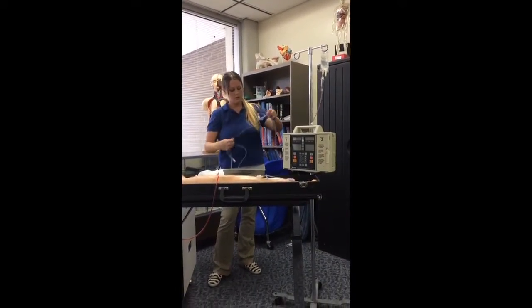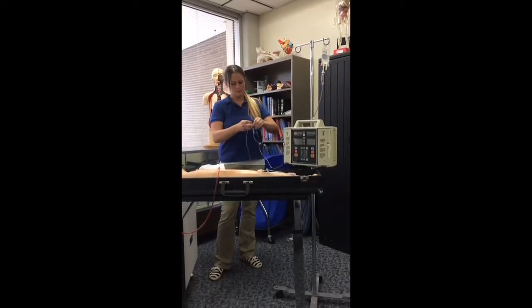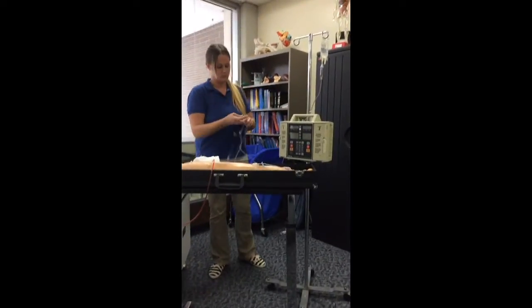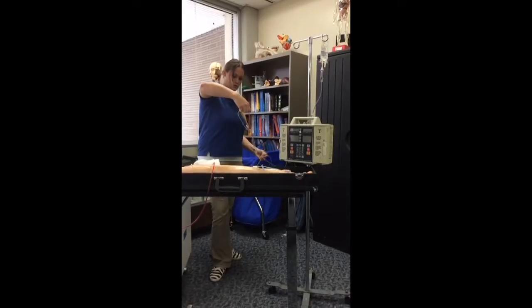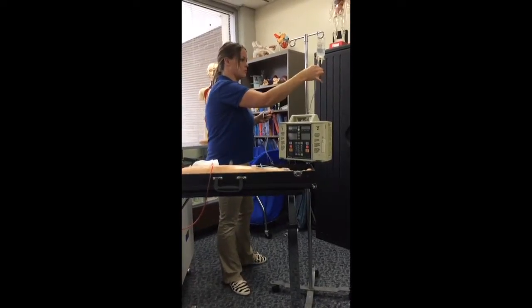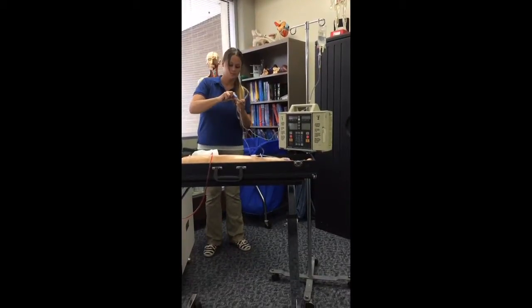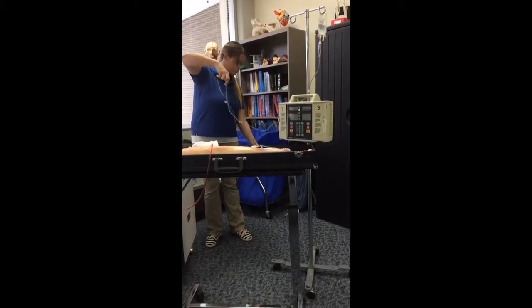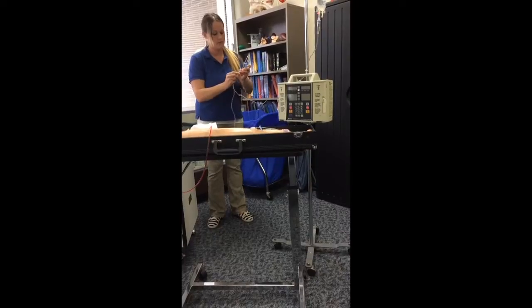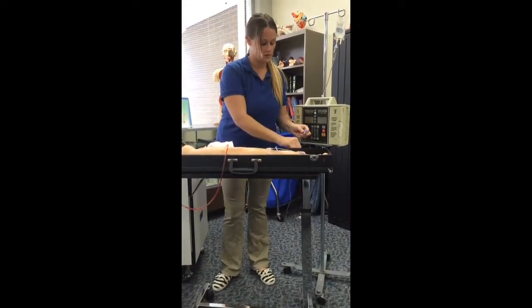prime the tubing, open it up, let it go all the way through. Clamp. Okay, perfect. Once it's all the way through, I will reclamp. Set this to the side.